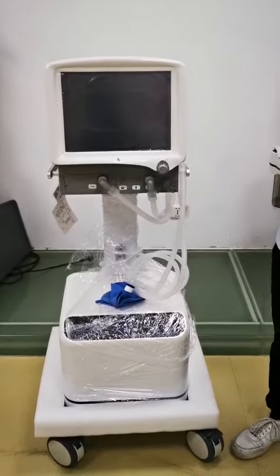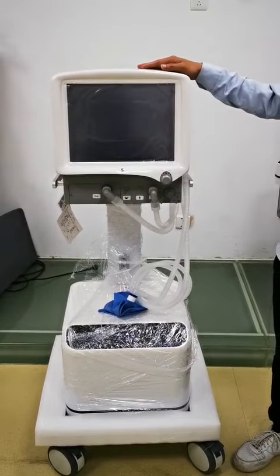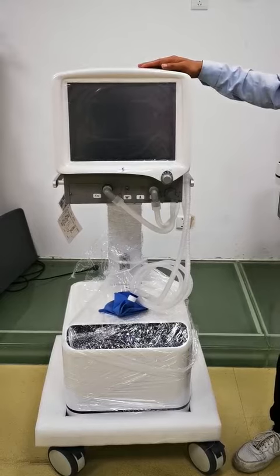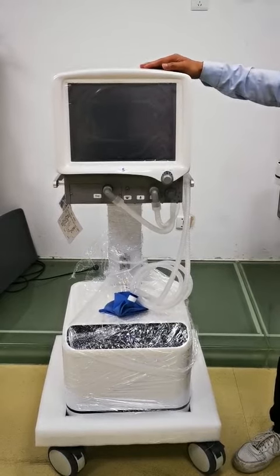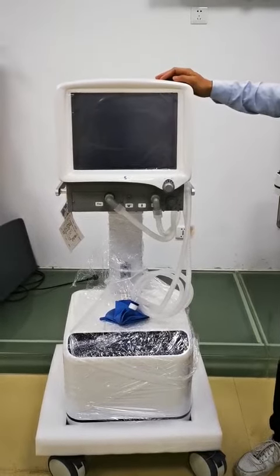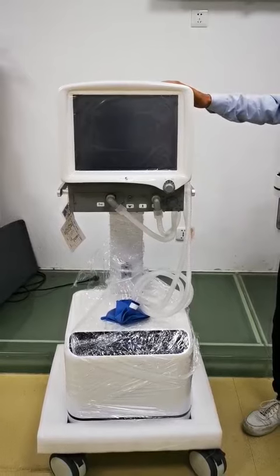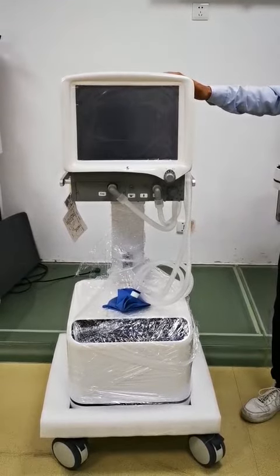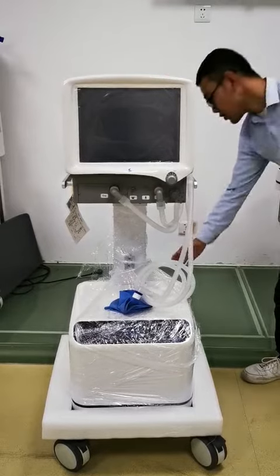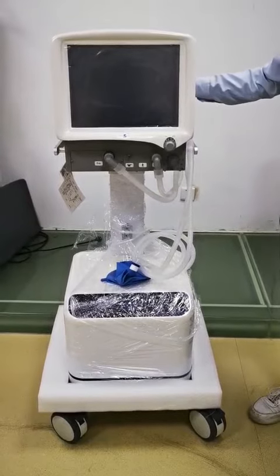Hello everyone. I will introduce you to the calibration method of the oxygen concentration for the SW1W ventilator. First, we will do the 21% oxygen concentration calibration. That means we need to cut off all oxygen supply and only offer the air supply — we turn on the air compressor and switch on the machine.